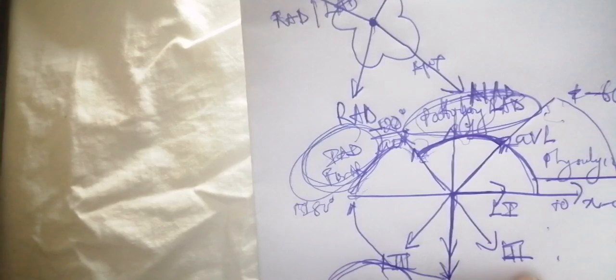Now, let's visualize how to calculate this axis deviation. In order for you to visualize the axis deviation, you must use limb lead 1 and limb lead AVF. Those are the two major leads that you use to visualize the axis deviation. After visualizing the axis deviation with both of these leads, if you have a case of a left axis deviation, in order to distinguish a pathologic from a non-pathologic left axis deviation, we now use limb lead 2.